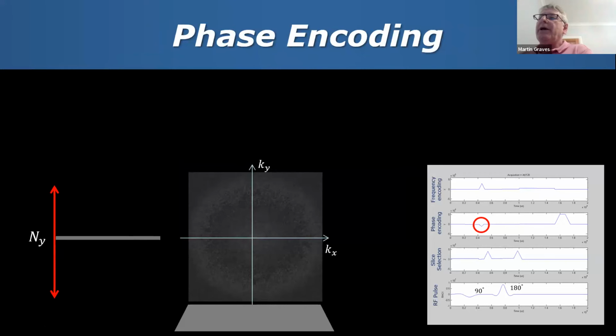So as I showed you at the beginning, most of the issues we have here are related to the fact that this phase encoding gradient gets stepped through from a negative value to a positive value, or in some other order, depending on how we acquire our data. So here, just in cartoon idea, I just want to show you quite what the effect of the phase encoding is.